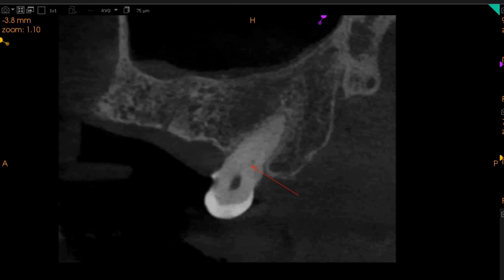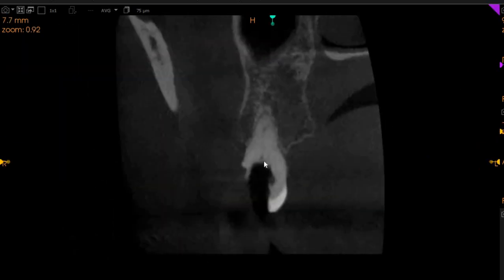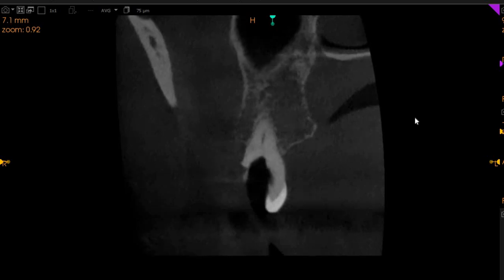Again, mesio-buccal, disto-buccal, and then we've got our very nice palatal right here. This is the palatal canal from another view — very sclerosed, but it is present.